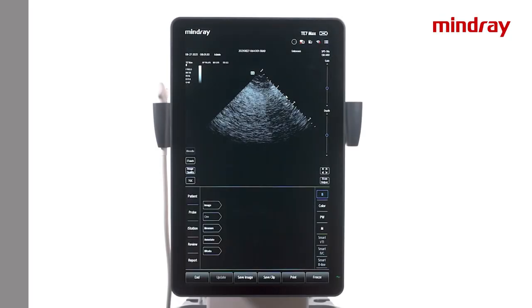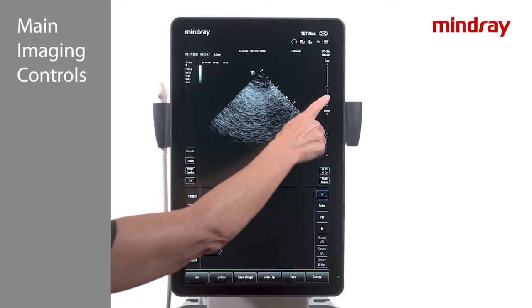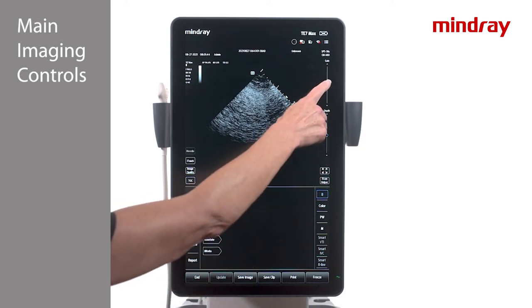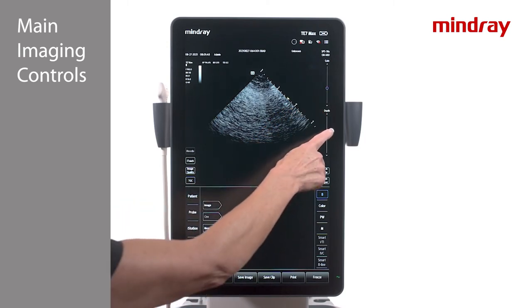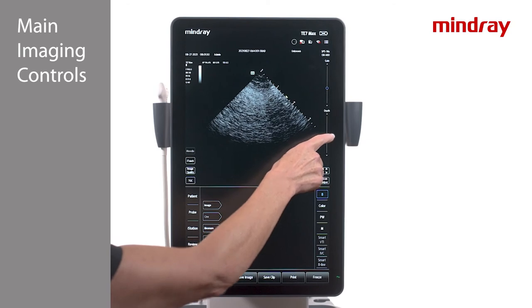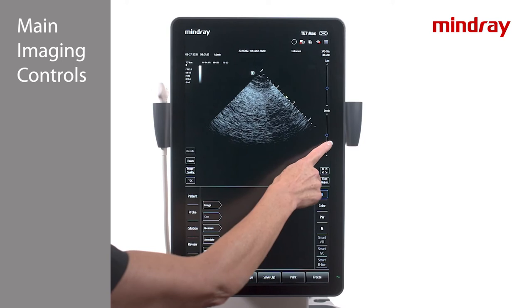On the right side of the TE7 touch screen is where the gain and depth controls can be found. For gain, up is brighter and down is darker. For depth, up is more superficial and down is deeper. Either slide the control pods or tap above or below them on the line to adjust.